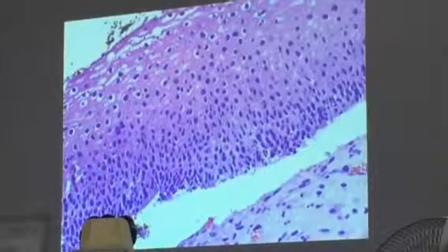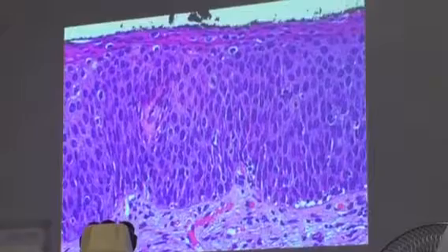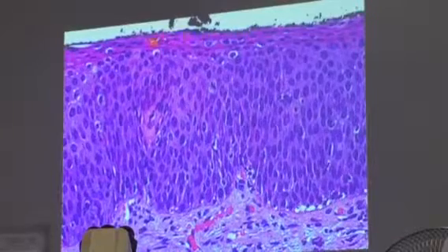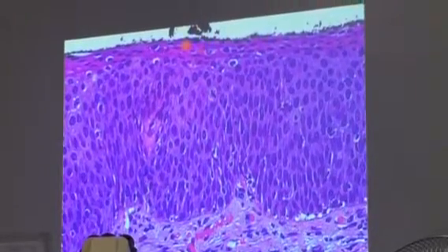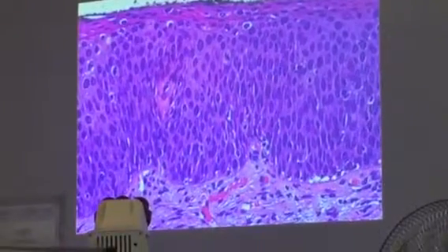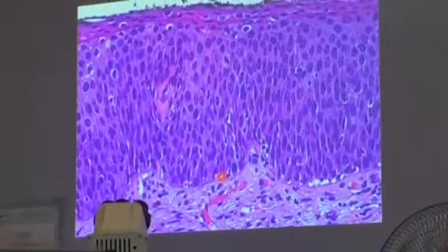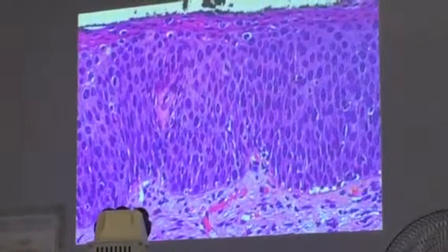2, or yeah, almost 3. Now this is CIN3. If the malignant cells breach, or rather are found in the upper layers, the upper layer itself, at the very top, then we can call it squamous carcinoma in situ. Take note that what is important is that it does not breach the basement membrane.